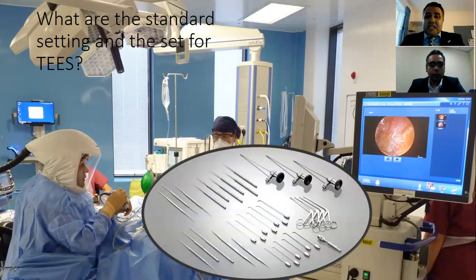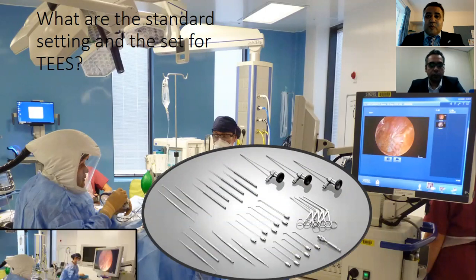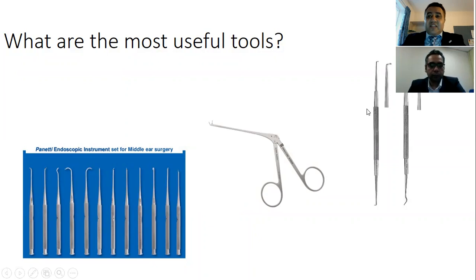There are many instruments you can use — there's no absolute good or bad instrument, it's just what you need. The most useful tool is the Thompson curved instrument — the 90-degree and 45-degree — which is very useful for going around corners. I've also used the suction-knife from the Panetti Endoscopic Instrument set. I find it a bit difficult to use personally, but many people like that type of set and it can be useful as well.